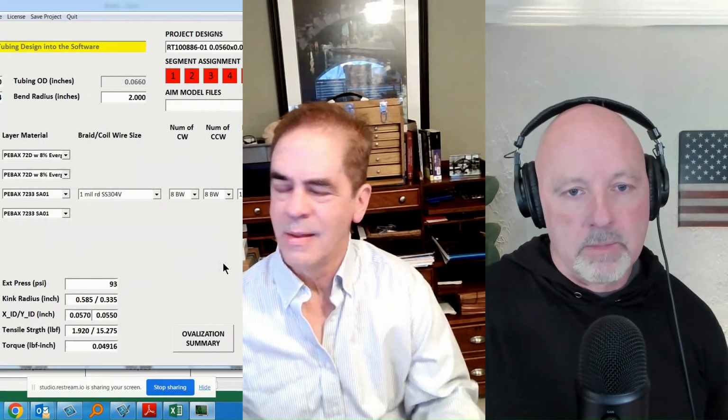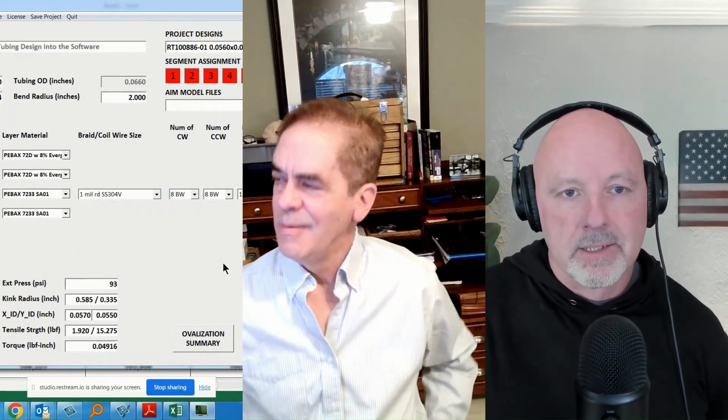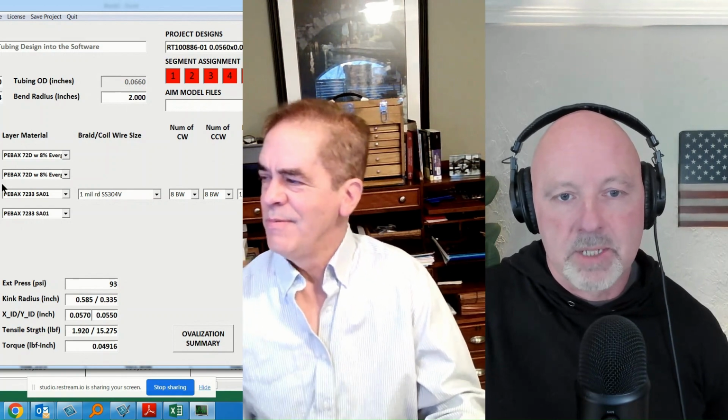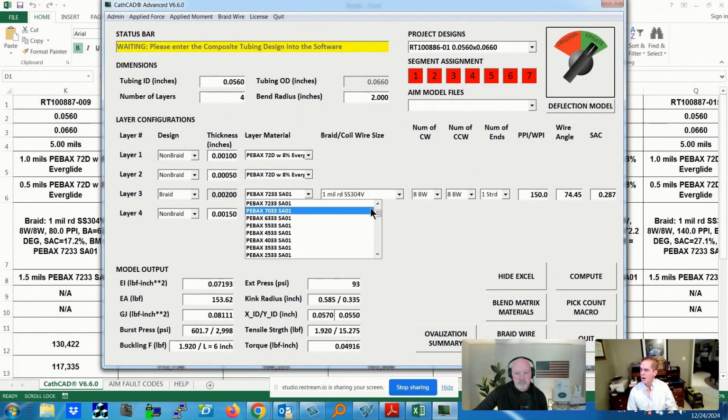And so just like you change the pick count, you could also, I mean, I saw there's a huge material database. You could change materials. Exactly. So that's more on a manual basis. So again, here's our standard library that we provide to the user.